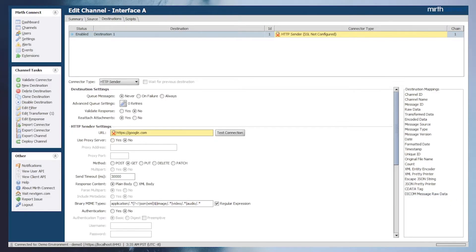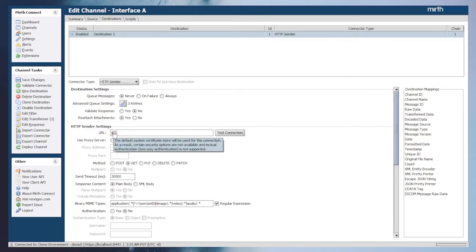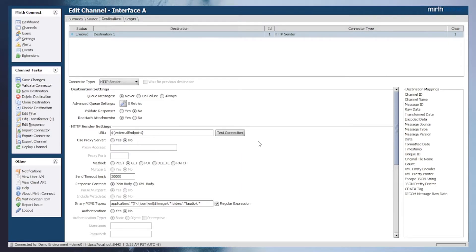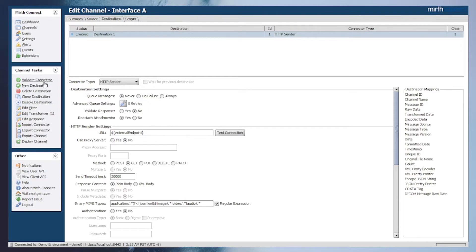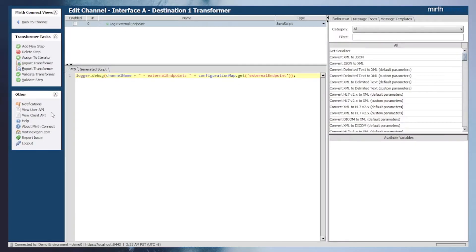Heading back into interface A, we can now update the URL with the newly created configuration map variable using velocity template syntax, which references our configuration map variable. Once we get that set up we can click Save. We'll go ahead and print out the configuration map variable before the request is made in order to see the final value that will be used to make the final request.